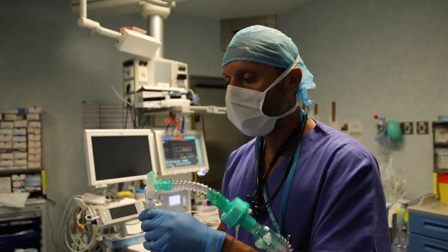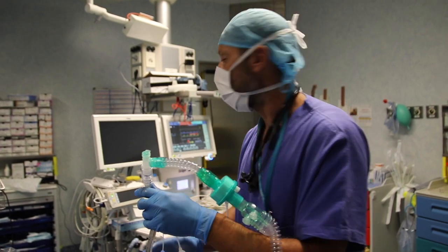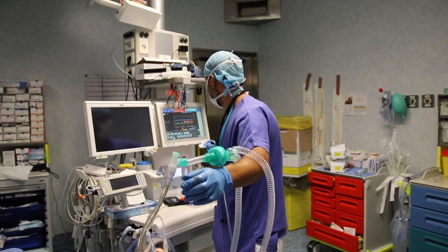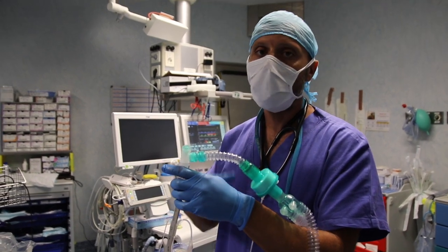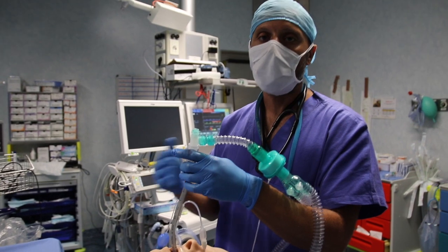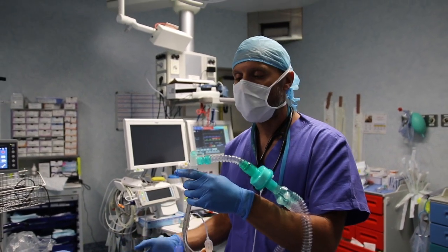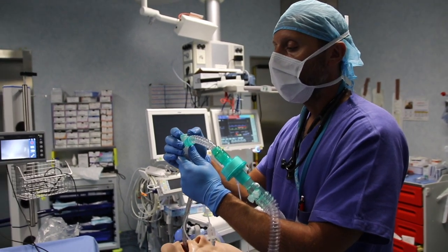Similarly to the rigid fibroscope intubation, we will perform the manoeuvre without interrupting the ventilation, which will give us all the necessary time to complete the procedure. This also means that the spritz tube can be of great help for training operators to use the fibroscope, since they can take their time and not worry about the apnea phase.